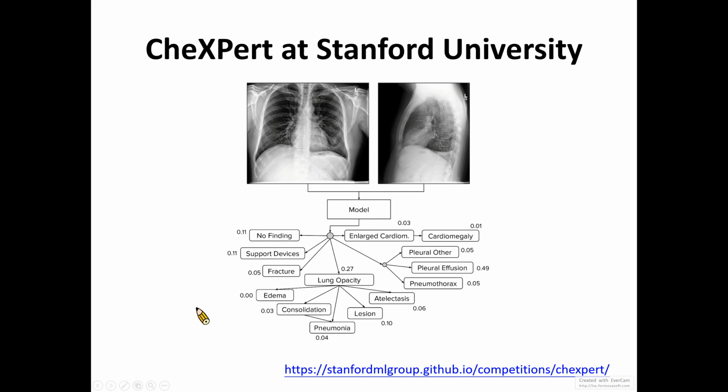So I show you this diagram to show the difficulties of the chest X-ray algorithms. In the previous challenges, we only needed to identify the pneumonia, but actually pneumonia is only one of the diagnoses you need to differentiate in the chest X-ray images. And there are other diagnoses you need to differentiate on these two-dimensional images.